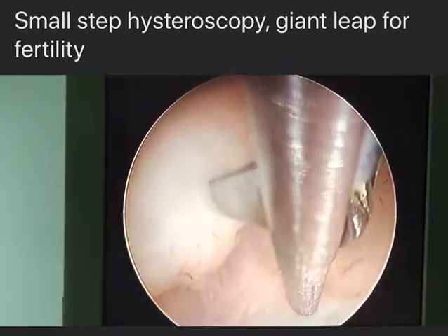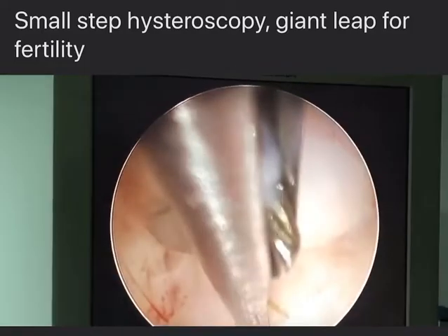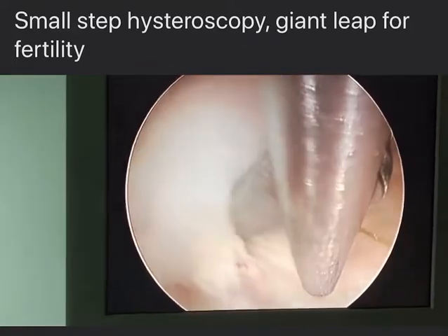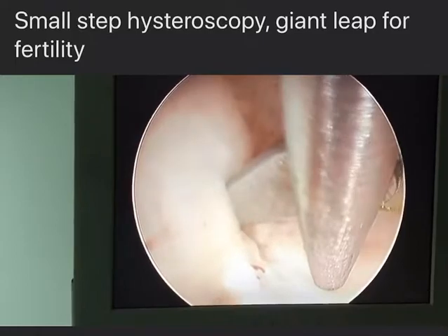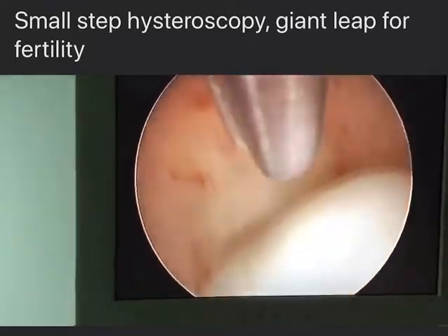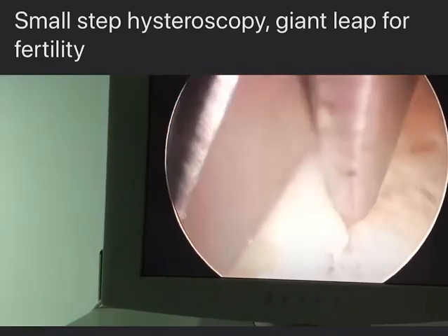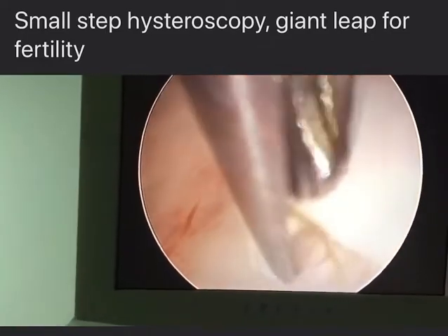Matadoro, you see how you elevate the myoma like this? I think I might not even need to cut. It's almost free, so I go behind and down and make like this.